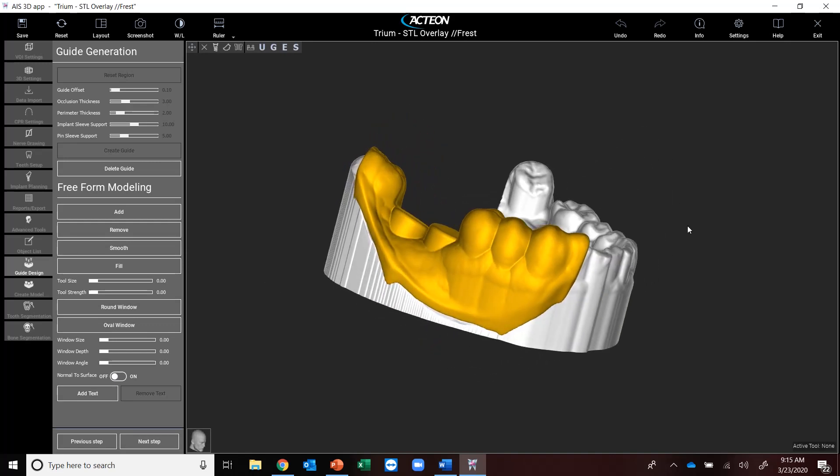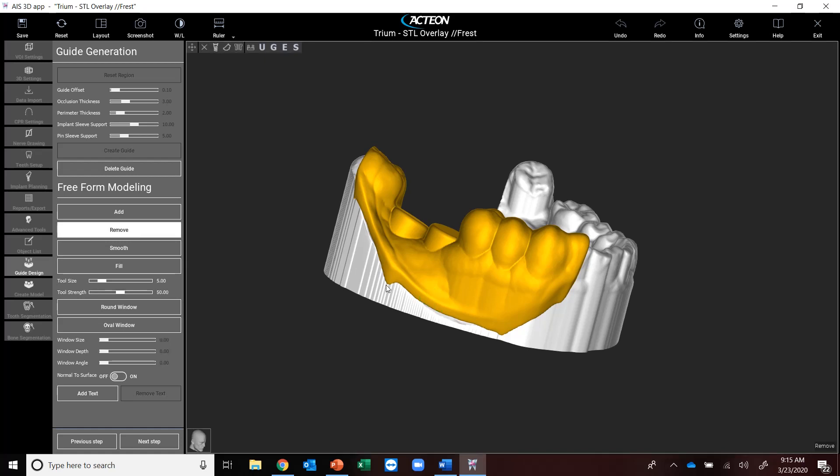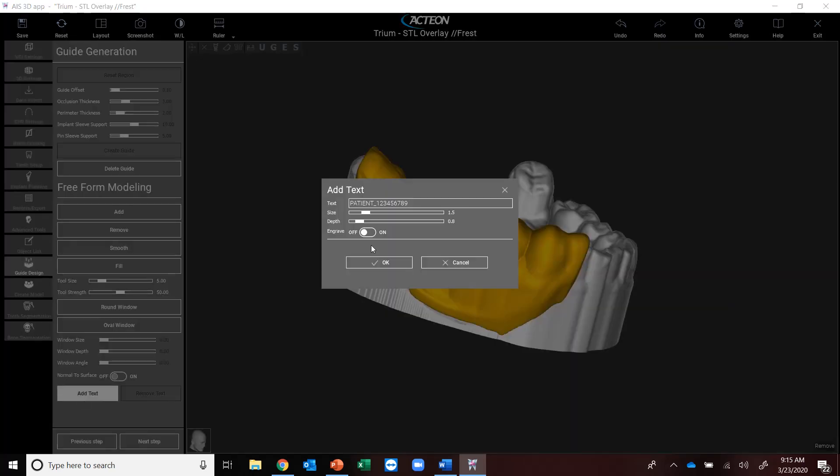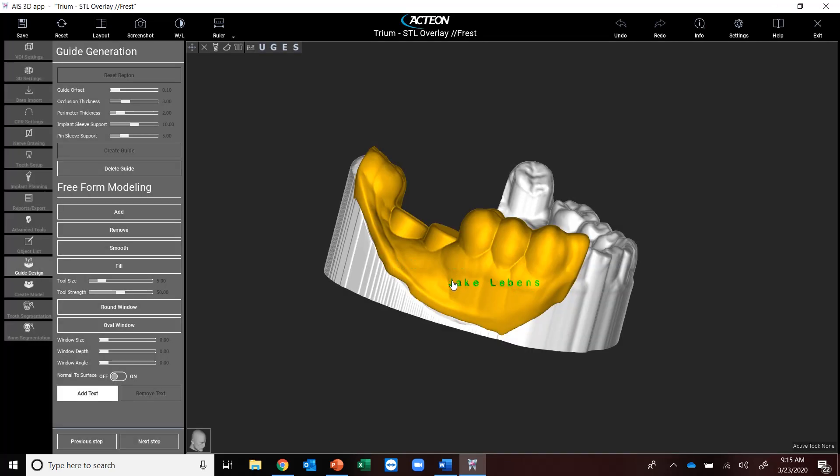It's going to populate the region. Now if I want to, I can remove some areas. Like say, for instance, right down here, I can remove this. And then also, if I'm a doctor that has a 3D printer and I print multiple guides at one time, I can add the patient's name. Put it on here. And then I'll say next step.